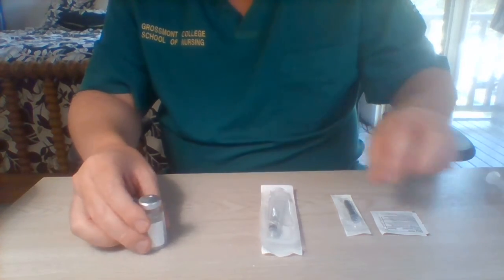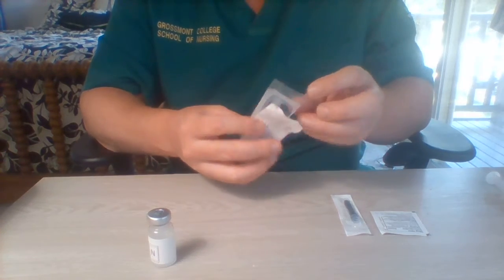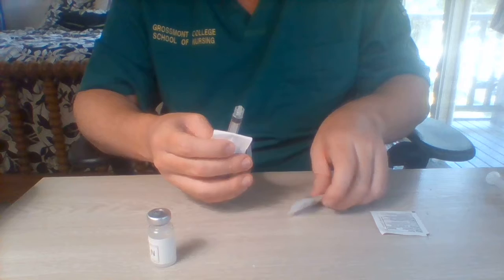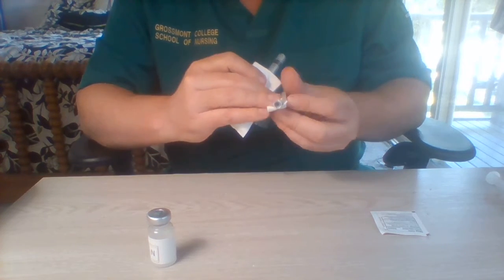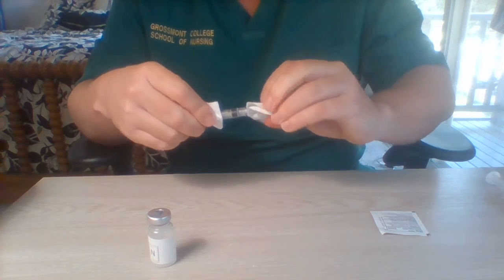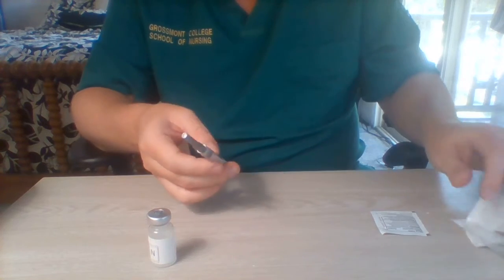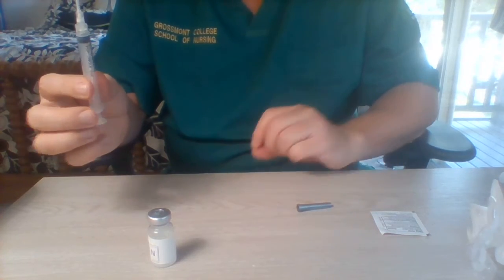Throw that away, let that dry, and while that's drying, I can open up my syringe and attach it.